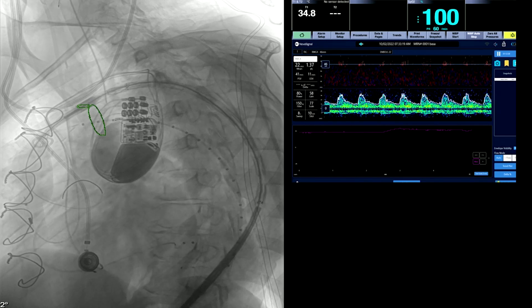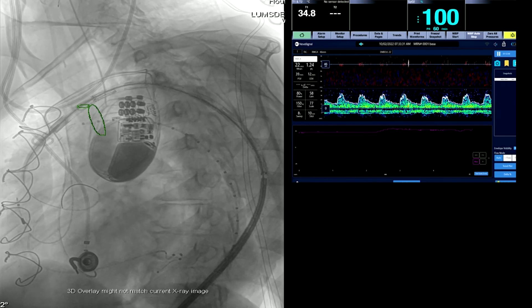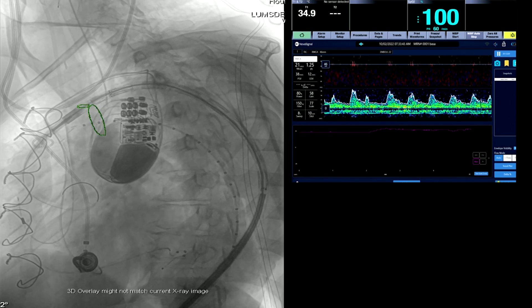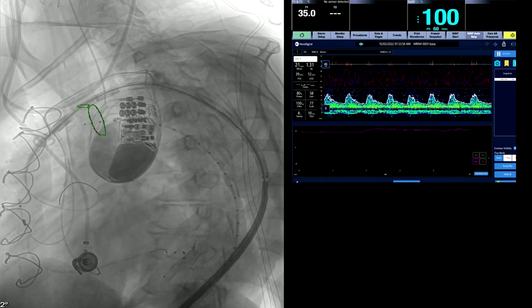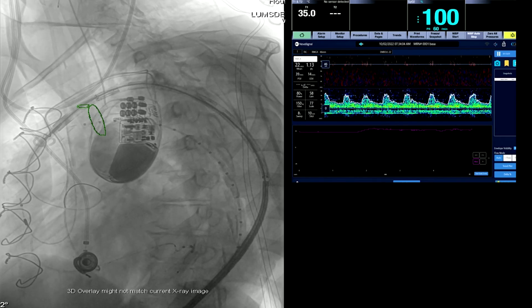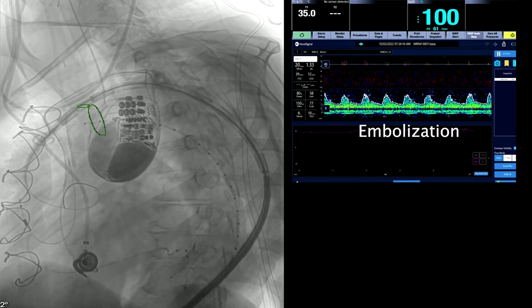This is a Cook Zenith Alpha. You can see we've put in a pre-curved Lunderquist wire — it could probably be in just a little bit further. The pigtail marker catheter is already up there, and we are positioning the proximal end of the endograft flush with the subclavian-aorta junction. You can see it's been positioned right there.